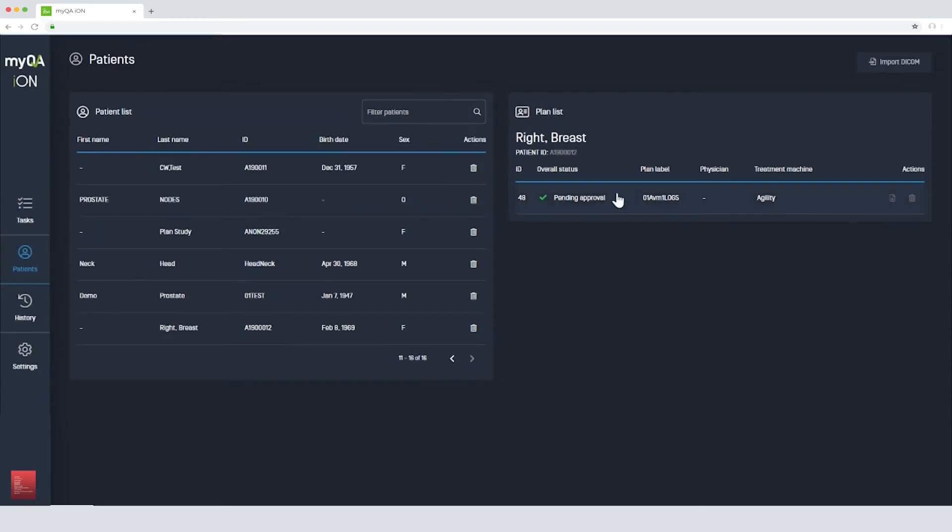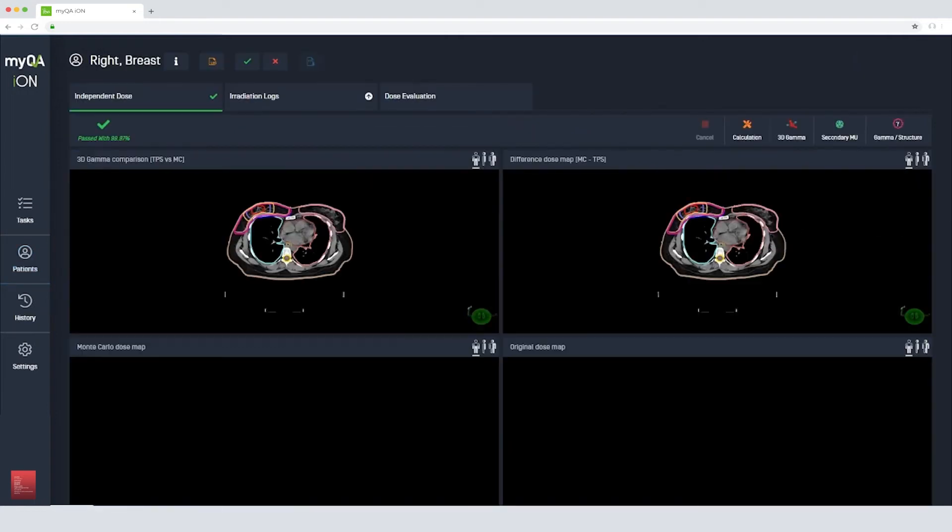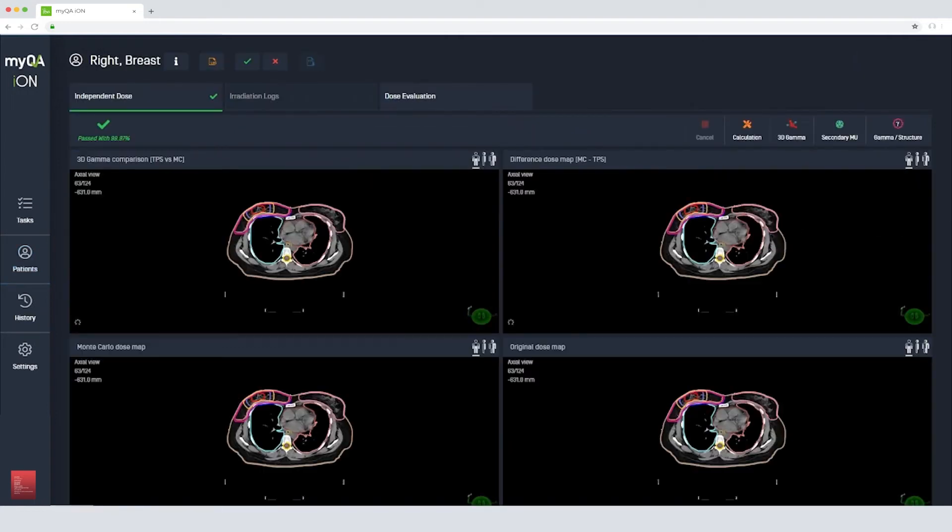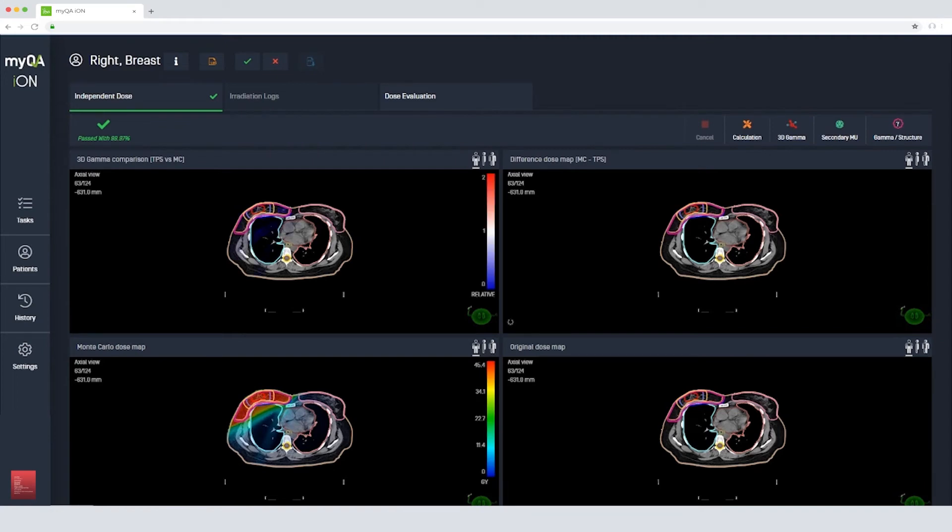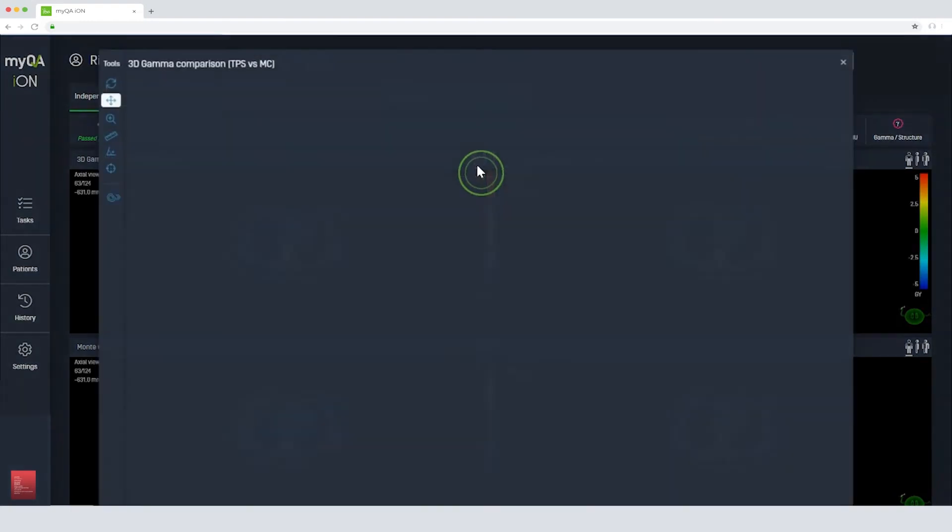We can now open the calculated plan. Here we can see the original dose from the treatment planning system, the dose MyQA ION has calculated, the dose difference between the treatment planning system and MyQA ION, and the 3D gamma index.